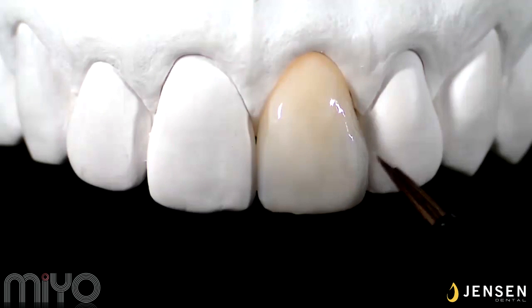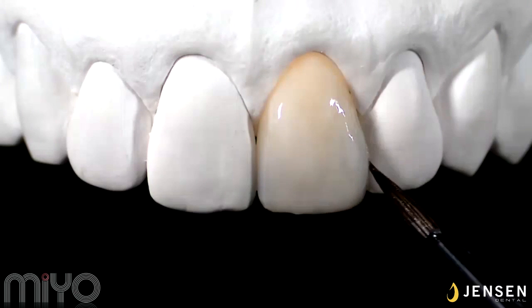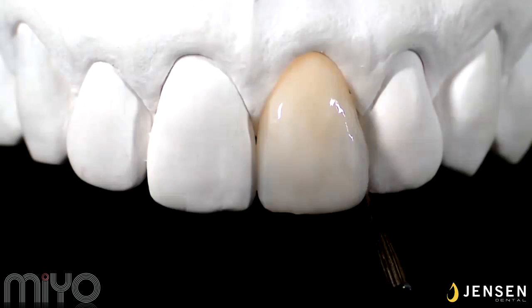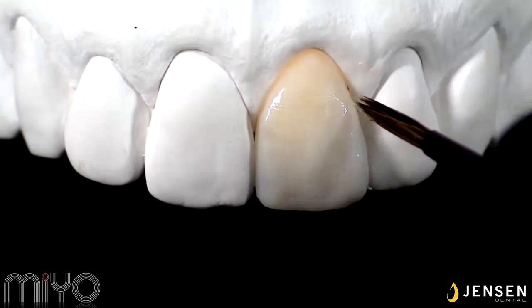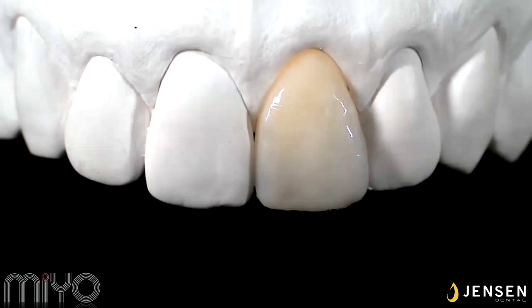To make my fine texture, ever so slightly go over the surface to create your perikymata. Then I would add my incisal edge to mimic the adjacent tooth and add some sharp corners and the correct stop on the incisal edge. Once I'm done with my final form and my final texture, I fire the restoration.